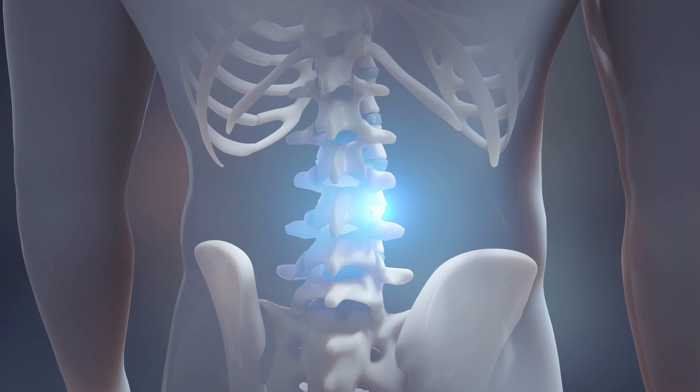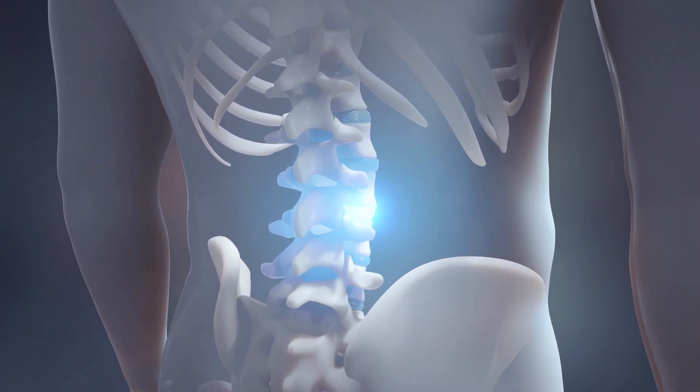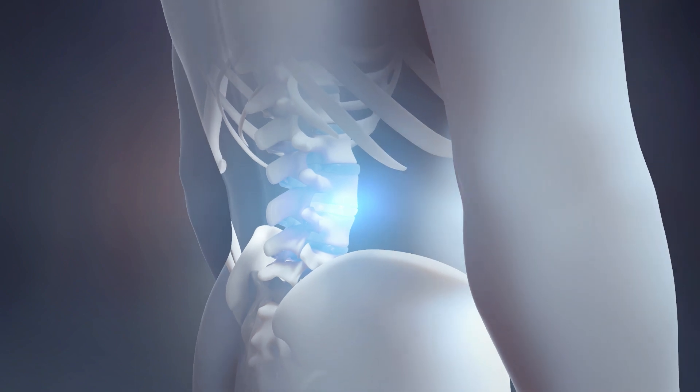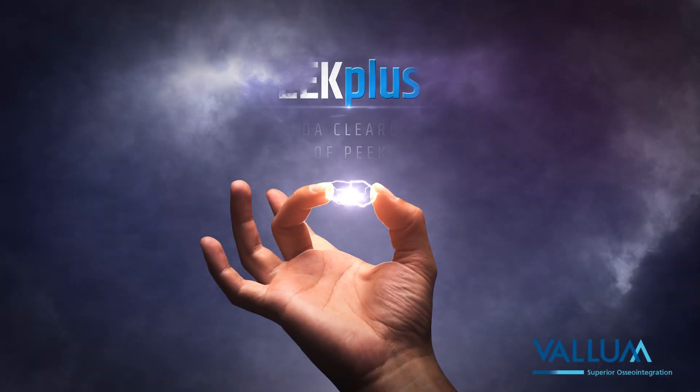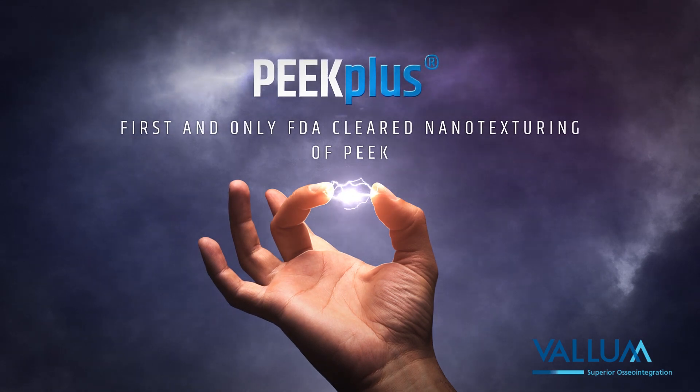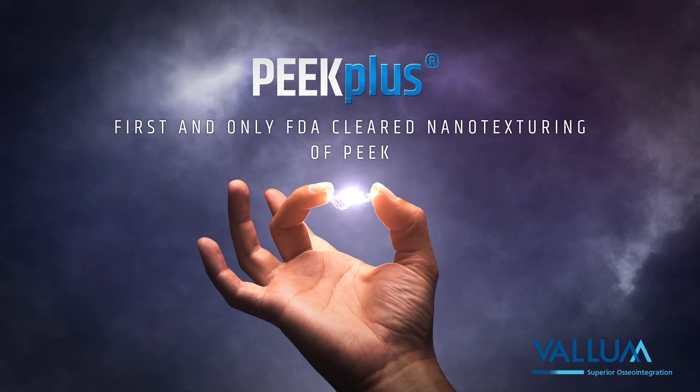PEEKplus is not a coating, nor is it porous or HA infused, but rather a true nanotexturing of the PEEK interbody device surface. PEEKplus is a disruptive breakthrough innovation in spinal fusion surgery and the first nanotexturing of PEEK to be FDA cleared.